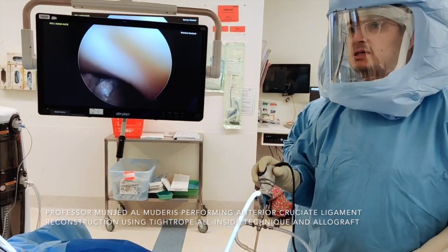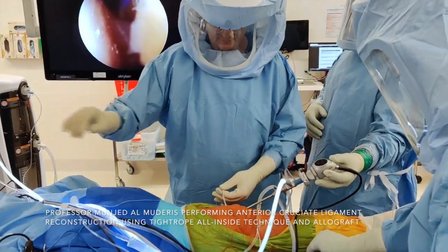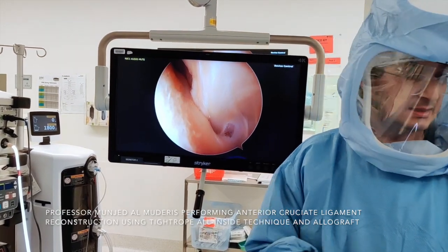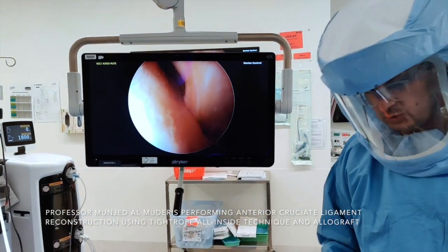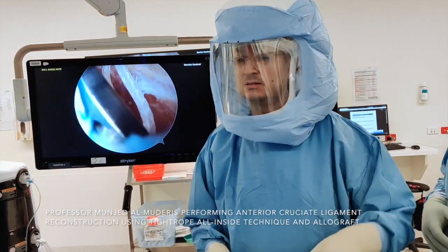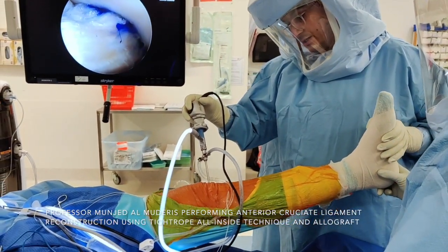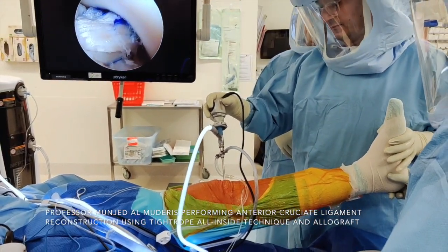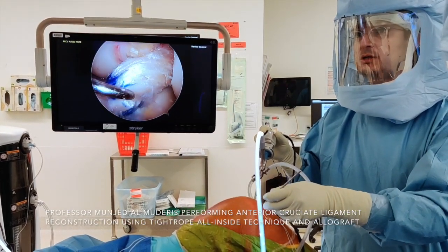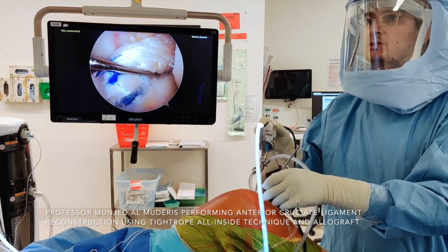You can tension the graft as much as you want and maintain tension. I then tension the tibial side and make sure that the button is seated without impingement on the capsule or the synovial membrane. Finally, I seat the button on the femur. There is tension on the femur now, so I can confirm that the patient can achieve full extension. Now we flex the knee.